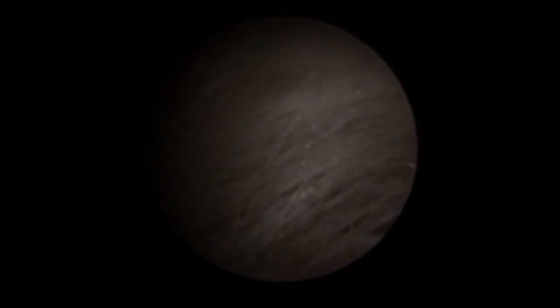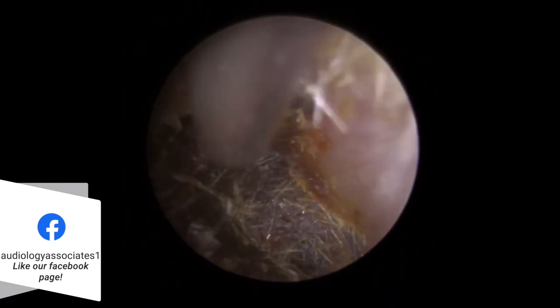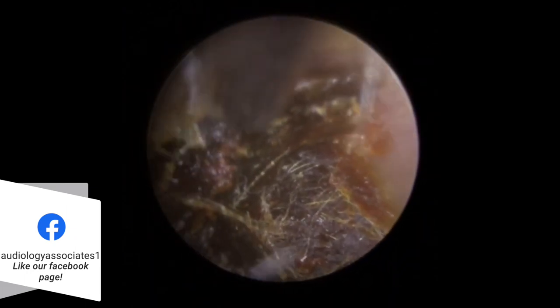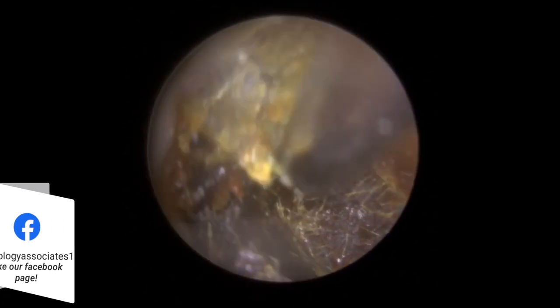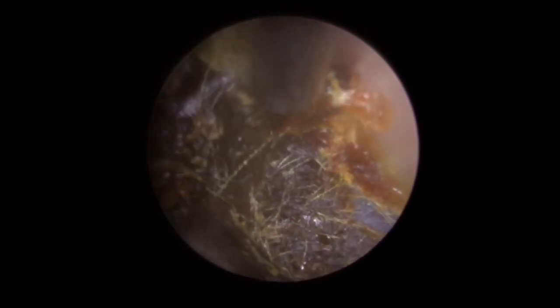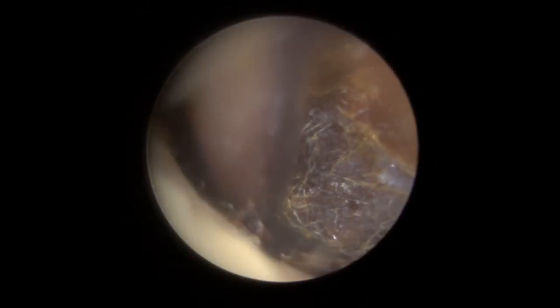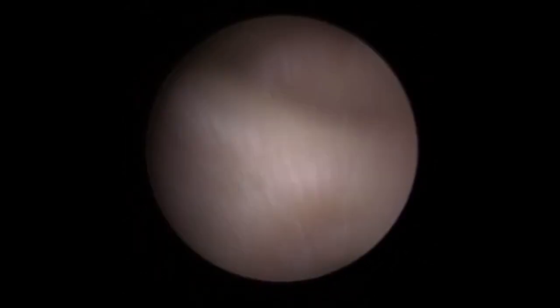The gap at the moment is a bit too small to fit a Jobson horn in — they're actually quite thick when you put them into little gaps like this. So I'm aiming to try and fold this top section of wax down. Rather than it folding the whole thing, it's just broken this front end away because it's quite dry and brittle. I'm going to try and fold a little bit more because I know I'm not going to be able to get a Jobson horn or forceps above that at the moment. As soon as you touch it, the whole section moves, and that rear section further in is actually sitting right on top of the eardrum.